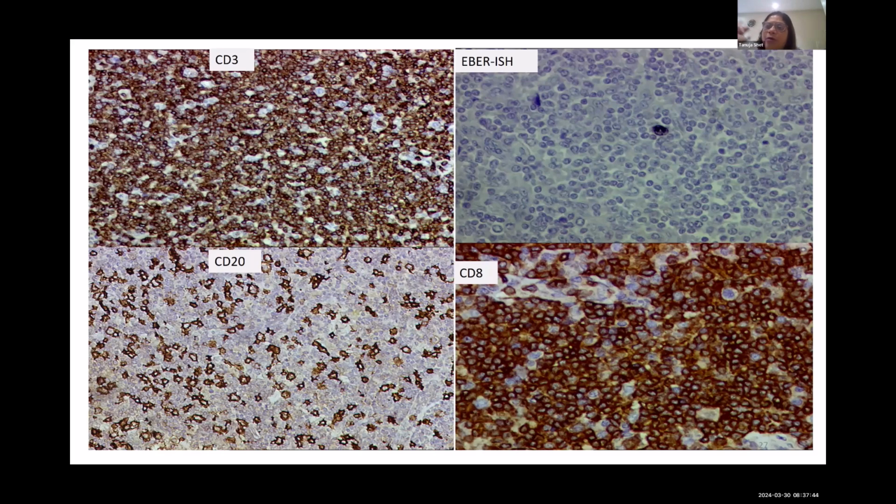Now, when you see a situation like this, where you have CD8 overwhelmingly positive, because most T-cell lymphomas are CD4 positive, the one thing that you should do is ask for a history of immunodeficiency. Even if this was a doctor's father, I always quote this case, because you don't ask these embarrassing questions to important people. And somehow somebody managed to ask, not me.